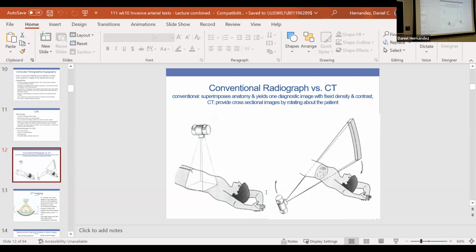So we'll have our vessel. We'll fill it with contrast. So we'll introduce contrast and we'll pick up that contrast within that vessel, causing that vessel to light up. So if it completely fills up with contrast, that refers to being fully opacified. This is fully opacified.